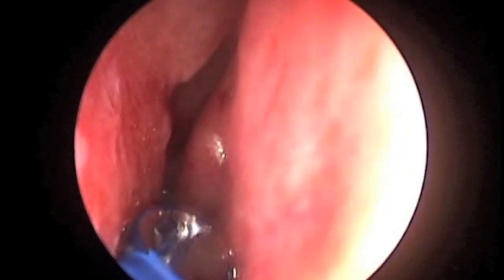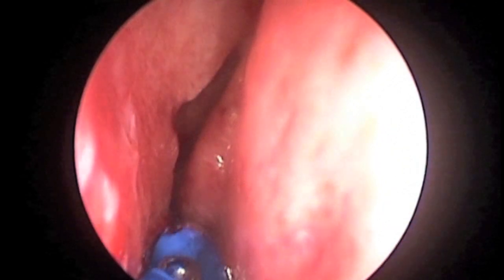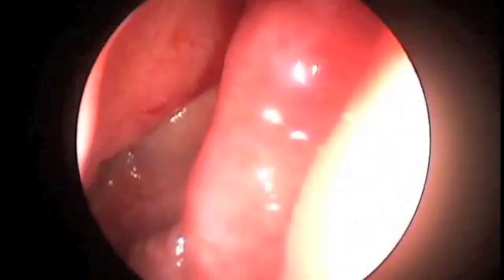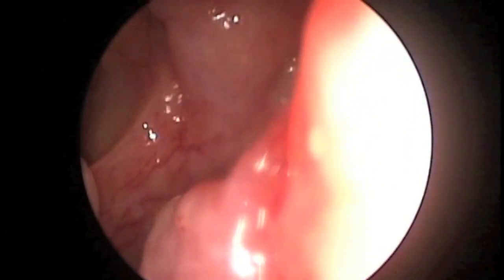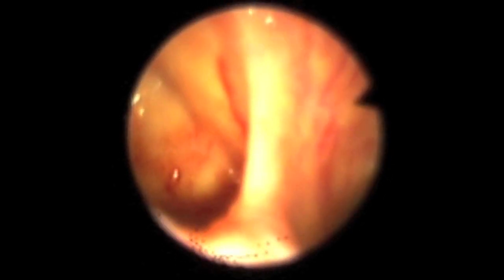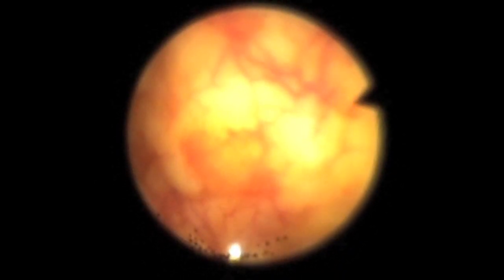This is inflated to about 10 atmospheres of pressure. It's then deflated, removed, and inspected. We see an adequate opening with thick mucus coming out of the sinus. Using a flexible scope at the time of the procedure, we're able to see that there is an adequate opening into the maxillary sinus.